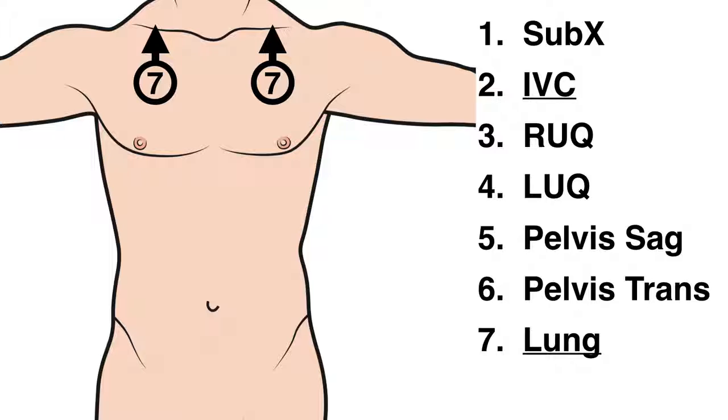You also want to view the heart as you have blood within the cardiac chambers, and you have a standardization of setting your gain for free fluid. Also, as we progress through these views, we are going to decrease the amount of gain and decrease our depth, working our way from the subxiphoid to the lung. So this way you are continually decreasing depth and decreasing gain rather than bouncing back and forth between increasing and decreasing both values, making for a smoother and more efficient scan.